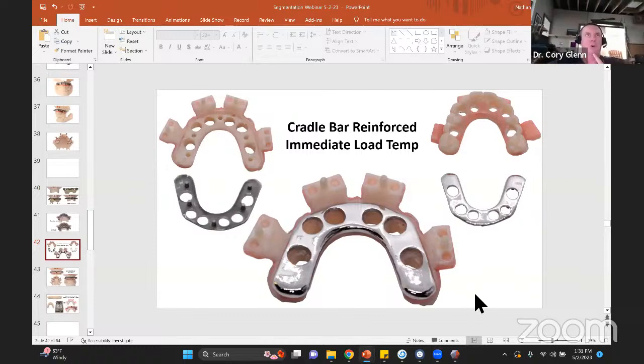I have, but Trilor, for those of you who aren't aware of what Trilor is, it's a resin reinforced fiberglass. So it's fiberglass, laid in all different directions, infiltrated with resin. Now, the downside to Trilor and really any kind of fiberglass is that it has to be fully encased. You can't leave any of it exposed to the mouth, even in its unadjusted state, because eventually it will wear a little and it leaves fiberglass exposed.